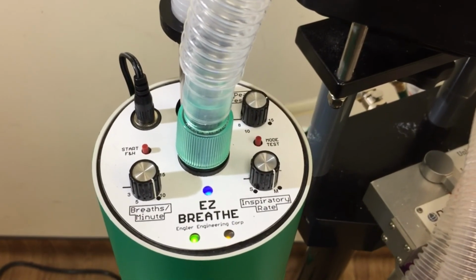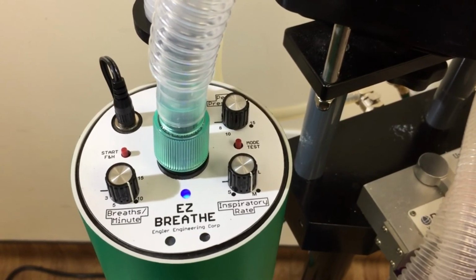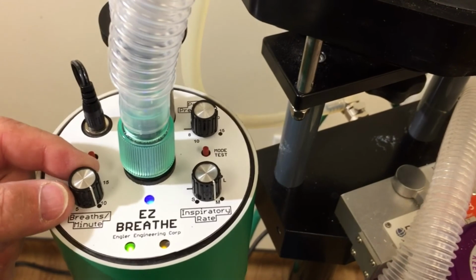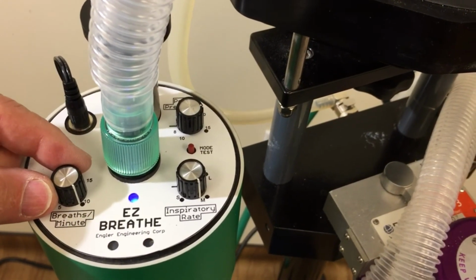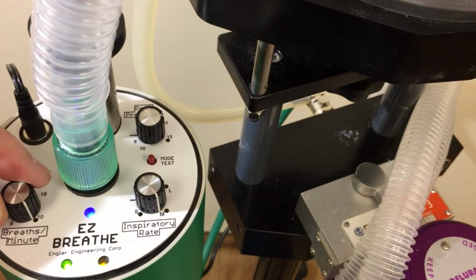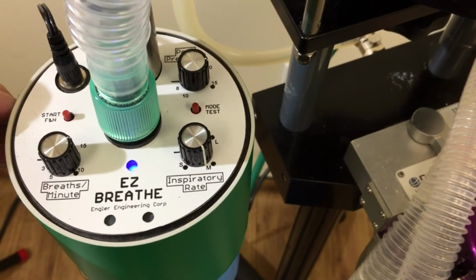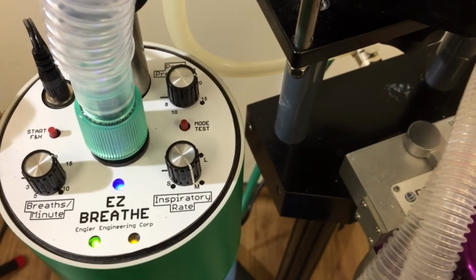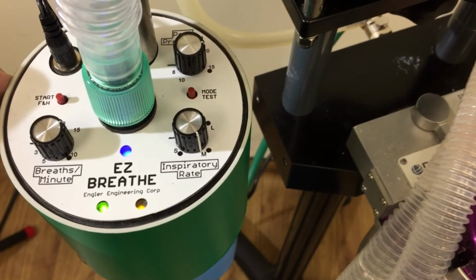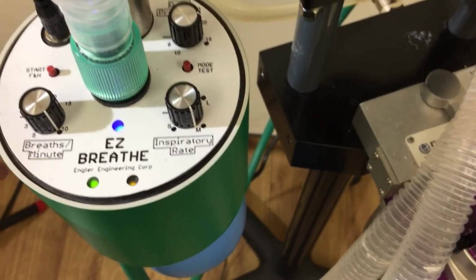Breaths per minute control. The breaths per minute control, as its name implies, simply changes the number of breaths delivered each minute by Easy Breathe. For most patients, somewhere in the neighborhood of 10 breaths per minute is adequate. For some small cats, small dogs, you might want to increase it. Changing the breaths per minute does not change any of the other parameters. As you can see, the inspiratory rate stays the same, the peak pressure stays the same, and the patient is ventilated. Instead of at 10 breaths per minute, it is now 15 breaths per minute. If I change it back, we go back down to 10 breaths per minute.